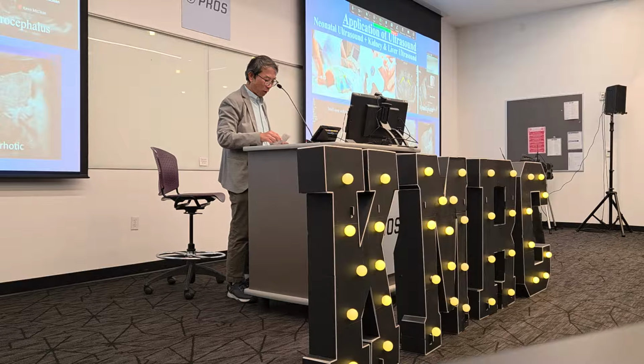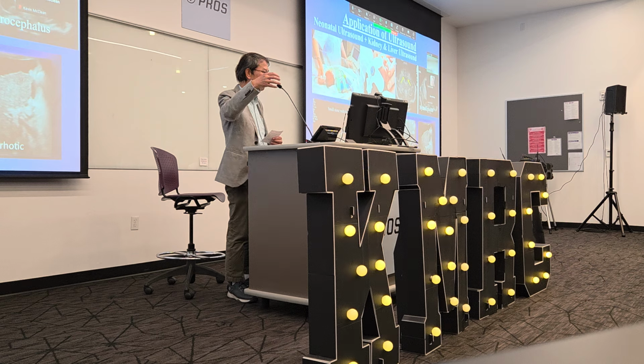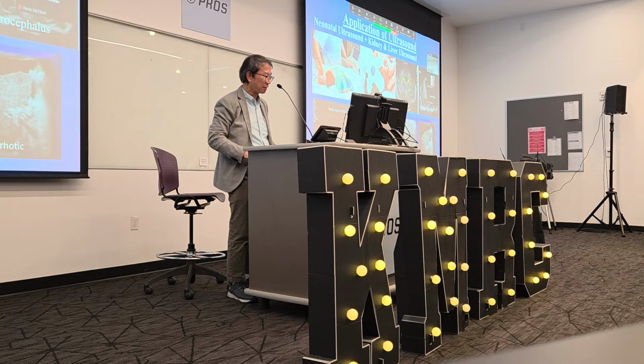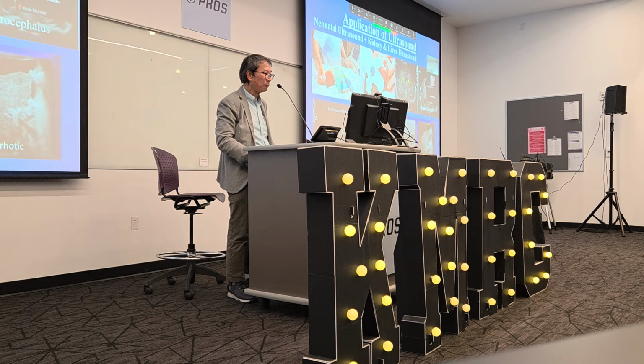Okay, so this is some illustration of the neonatal ultrasound. I worked with another team to design the transducer, so the radiologist can hold it to scan the baby. There's a fontanel here, a soft spot in the skull when they are young. In the middle, there's a Neo Doppler, which continuously monitors the blood flow inside the brain. If it is normal, this is the image you can see, but if it is not normal, you can see they are quite different.